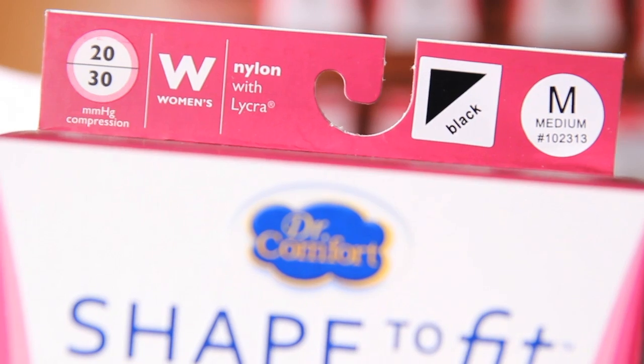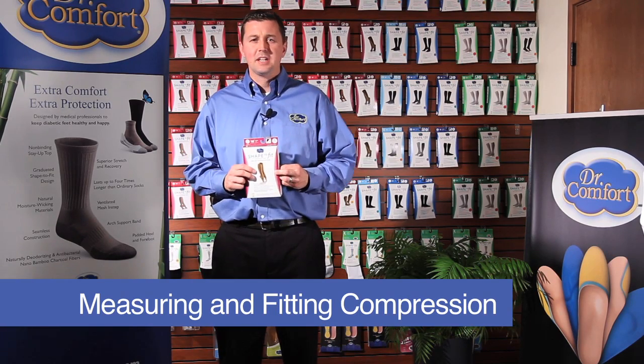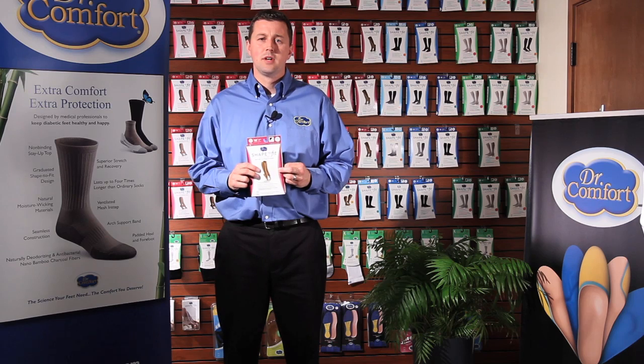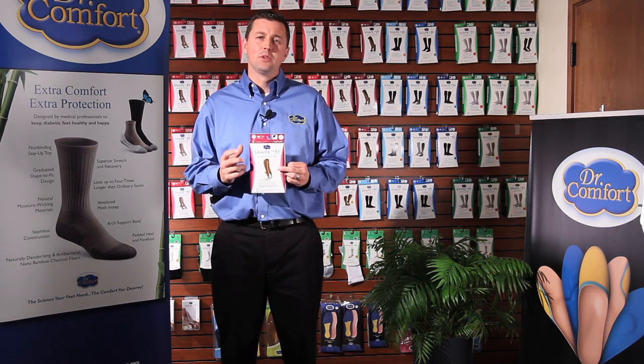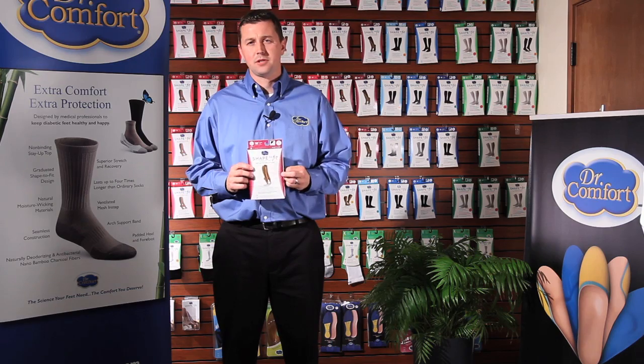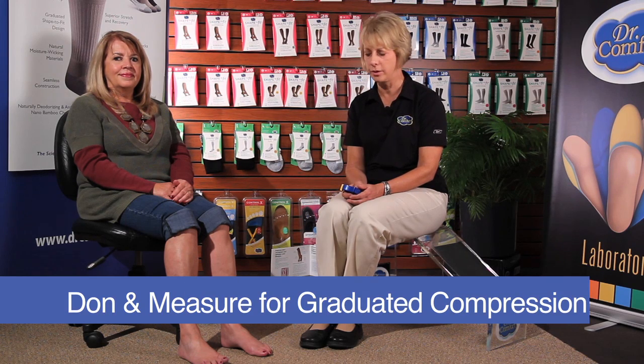In this video, Linda will be demonstrating measuring and fitting for compression wear, which in my opinion is easier than measuring for shoes. Through the use of assistive devices and these helpful tips, it will ensure success for you and your patient. Hi, I'm Linda Hagan, and I'm with Dr. Comfort Shape-to-Fit. Today, we're going to show you how to don and measure for graduated compression hose.